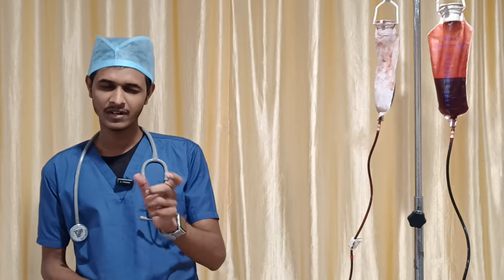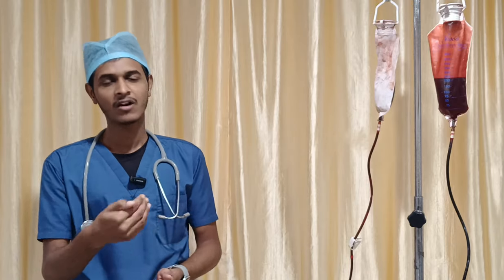So, in the procedural part, the second part, today I want to give a demonstration of peripheral intravenous cannulation. Before getting into the procedure, firstly we'll take a flashback of the whole procedure. First, I want to start with the introduction or the definition of peripheral intravenous cannulation.